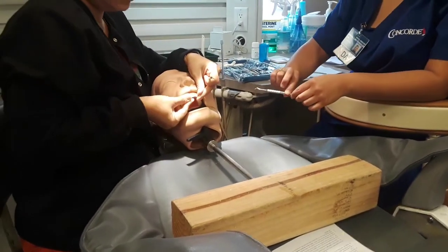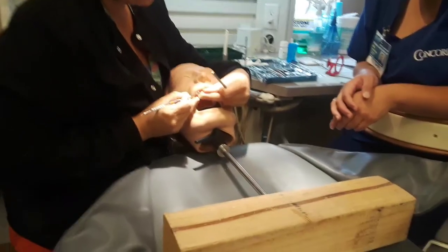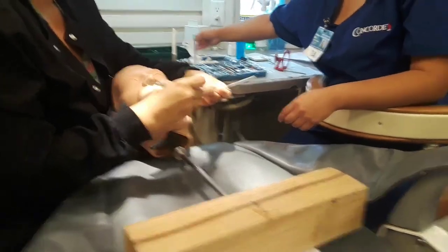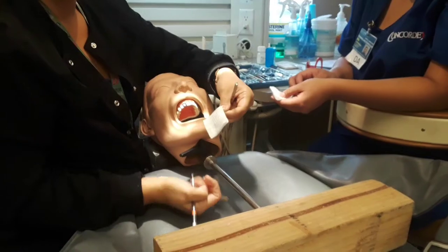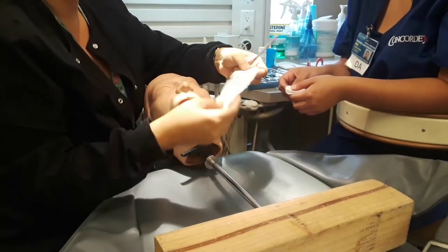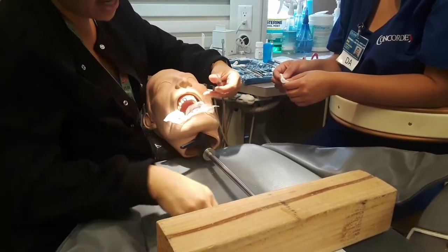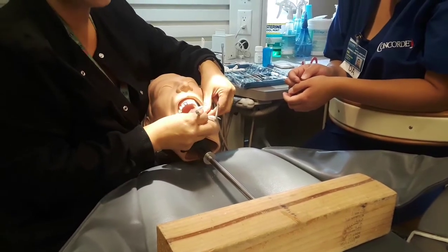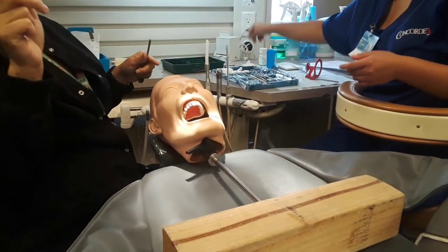Remove the temporary crown with a small spoon excavator. I'm going to put it right here at the margin and press down — the temporary cement should release it easily. Here's another way: she's going to grab it with her hand to protect it. Your doctor may also require you to do what we call a throat pack. So we're going to open our gauze and set it inside the mouth. When we peel it off, that gauze will catch it — so we call that a throat pack so it won't go through the throat.